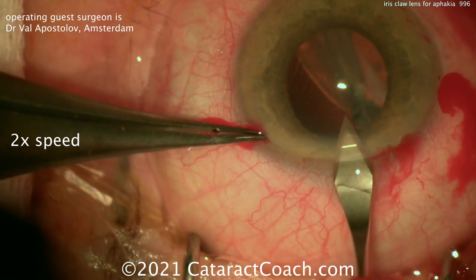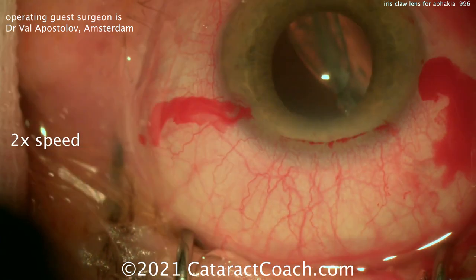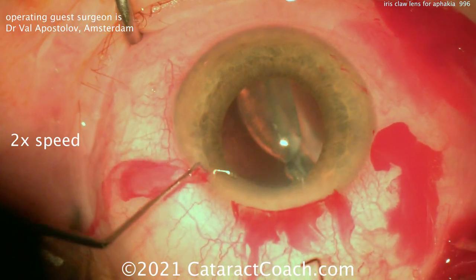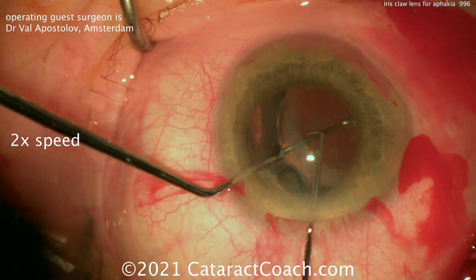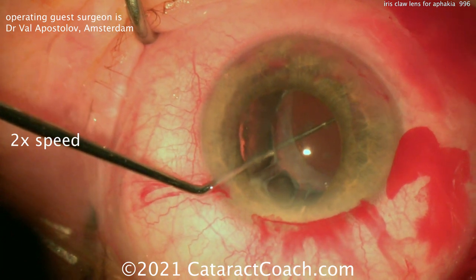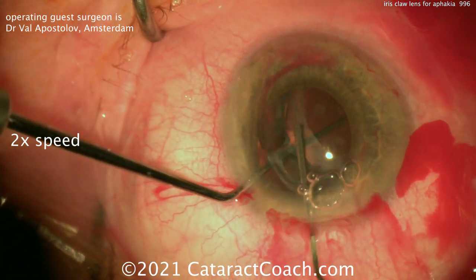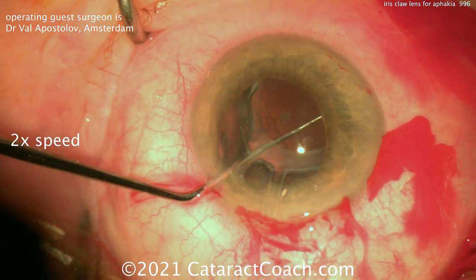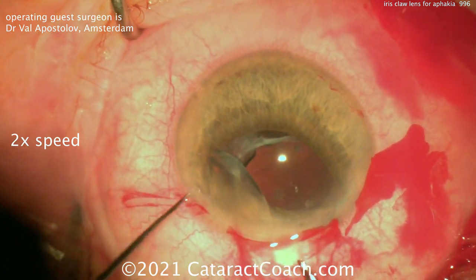You can see the IOL and capsular bag are really just hanging back into that anterior vitreous. This is absolute loss of zonular support in more than half of the clock hours. Two choppers are used just to secure that lens and bring it up to the iris plane and through the pupil. You can see the capsular bag is not at all attached, and what little zonular support is still there is very weak.